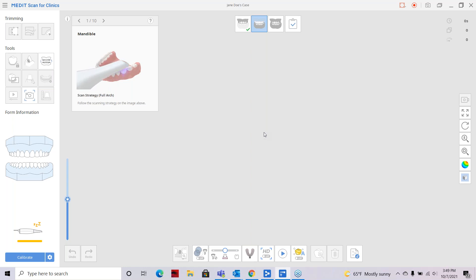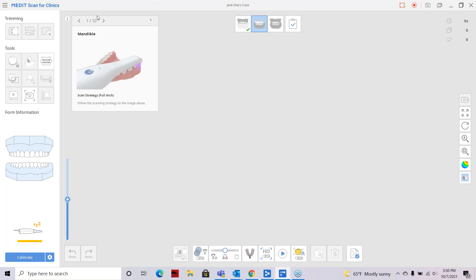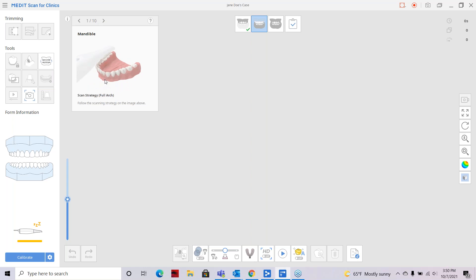With smart stitching, you're able to skip around in the mouth a little bit. The information and data will be saved and then joined by the software. We're also going to talk about scan path. Medit provides these little tools that illustrate the basic scan path — zigzagging across the incisal edge and going back on the occlusal surface.